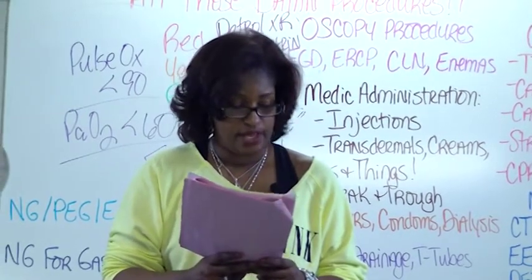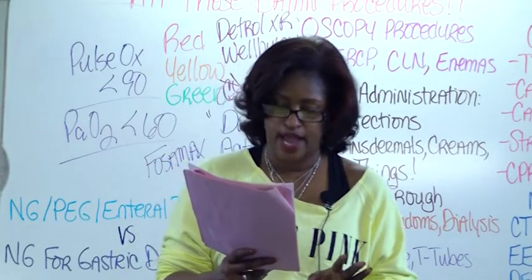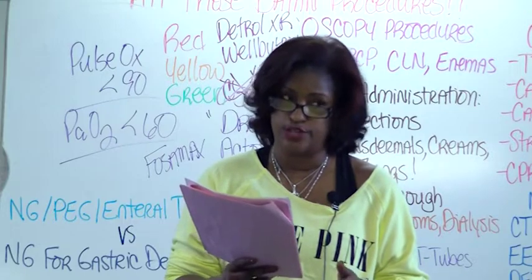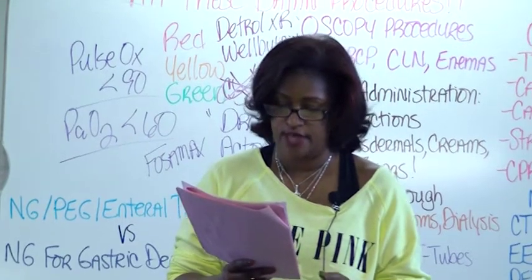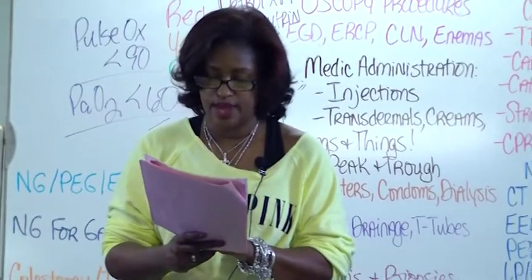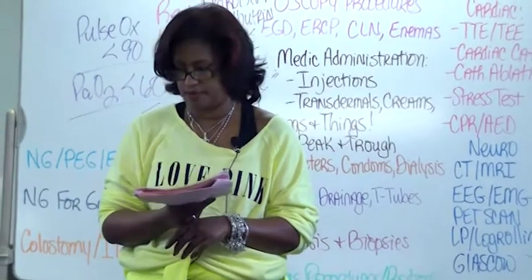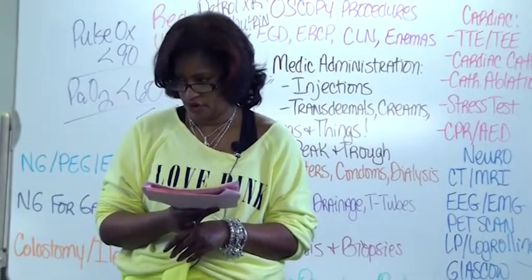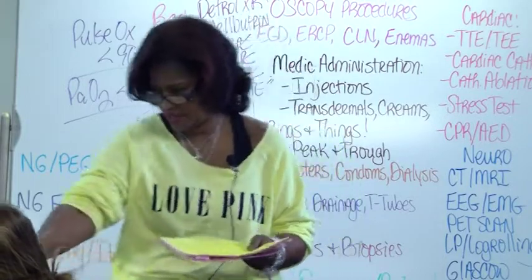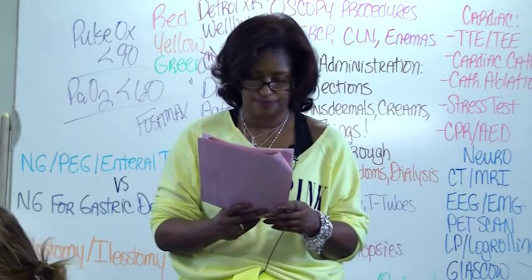Number 3, liquefy the medication. Once you are at the bedside and you've introduced yourself and you check their 2 identifiers and explain what you're about to do, you have to liquefy each medication. Please highlight 30 cc's of water separately. 30 cc's of water. You're in the wrong one. It's the one that looks like that. 30 cc's of water separately.